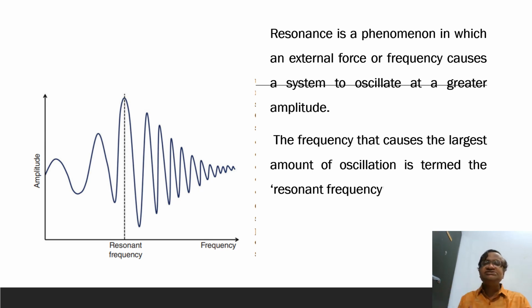What is resonance? Resonance is a phenomenon. I will tell everything very clearly, slowly. Resonance is a phenomenon in which an external force or frequency causes a system to oscillate at a greater amplitude. The frequency that causes the largest amount of oscillation is called the resonant frequency.